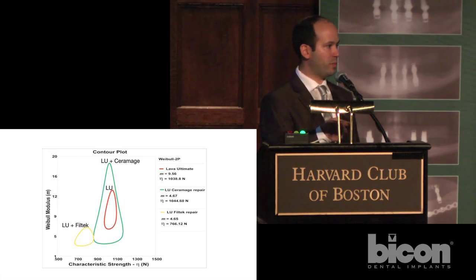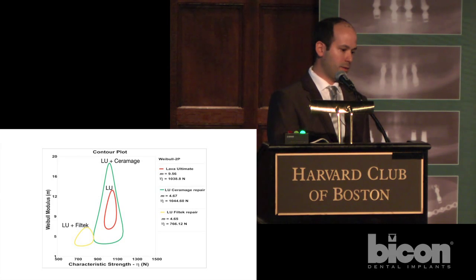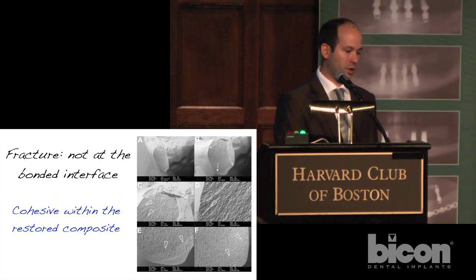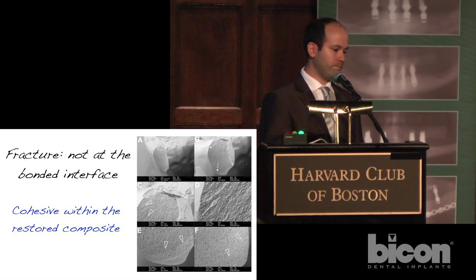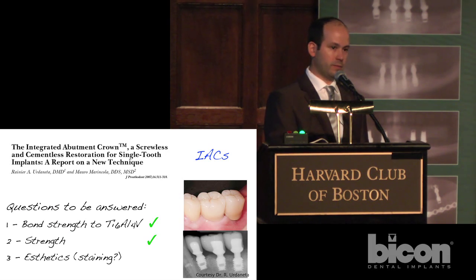So is repairing composites a safe procedure? Yes, it is. And most interesting, this was really fun to see: the fracture that we observed in fractography never occurred at the bonded interface. It was always cohesive within the composite. Okay, so then we answer the second question regarding strength.